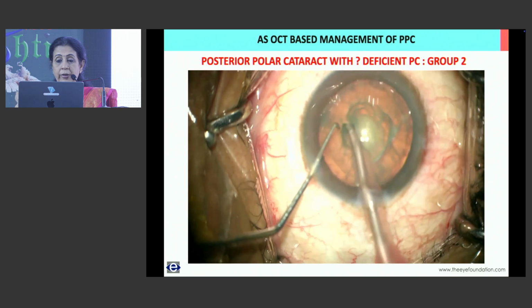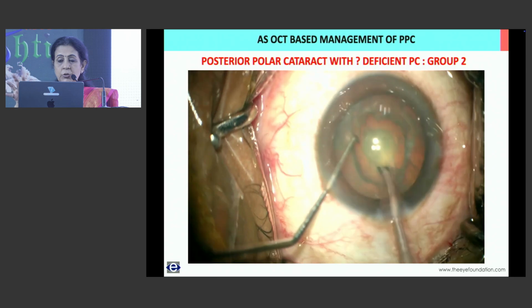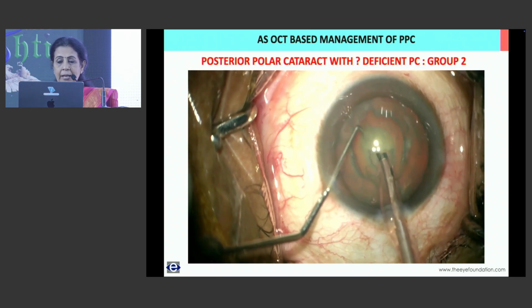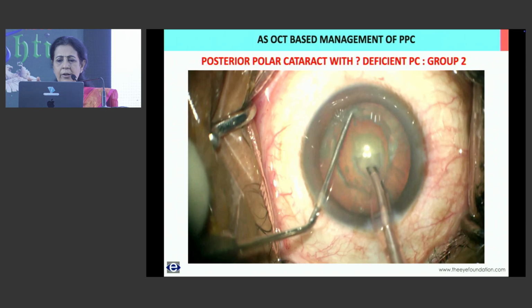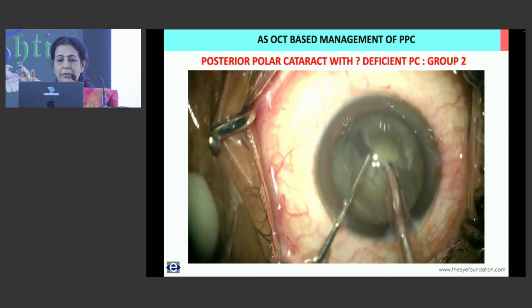I see that golden ring. And I'm not going to rotate the nucleus. I'm going to debulk the superficial epinucleus. Then I make a small trench because it's a moderately hard cataract. And then this gives me a better approach to do my direct chop.